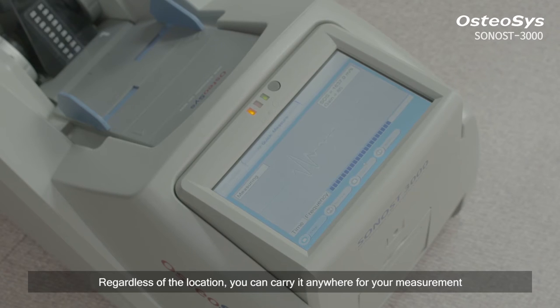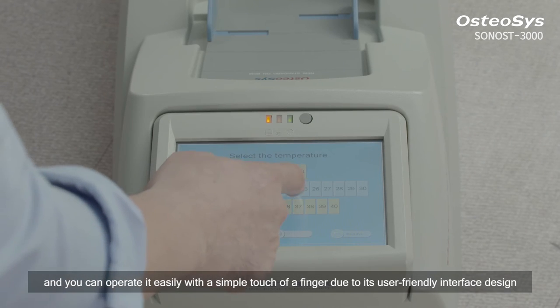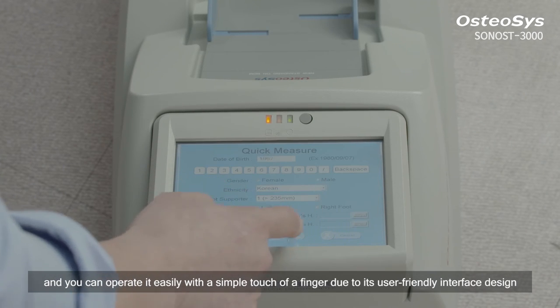Regardless of the location, you can carry it anywhere for your measurement and you can operate it easily with a simple touch of a finger due to its user-friendly interface design.